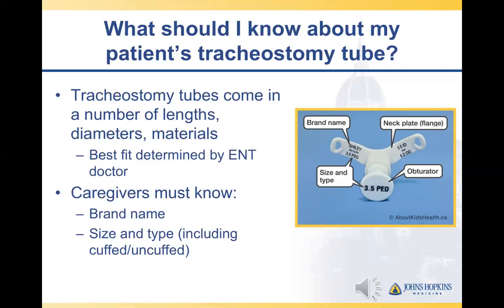All of a patient's caregivers should know the type of tracheostomy the patient is using. This should include the brand name and the size and type of the tracheostomy tube, for example, if it is cuffed or uncuffed.